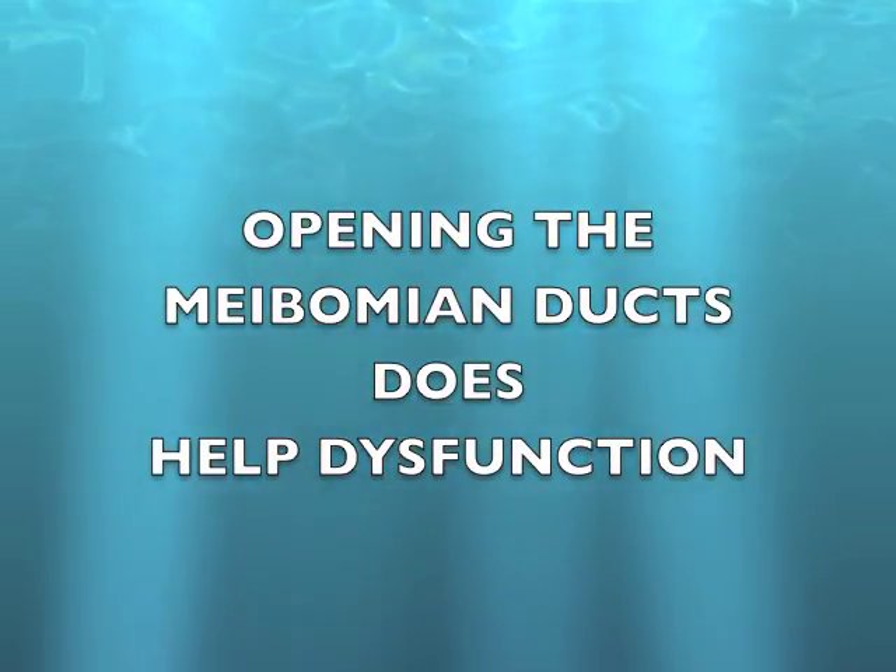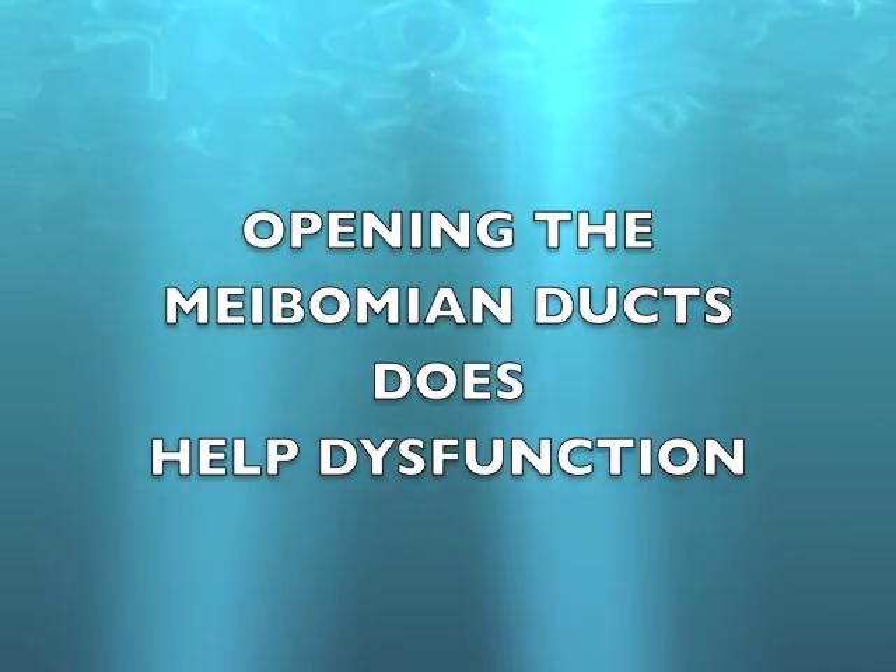Now you compress the two lids together. Pressing the lids together brings out the secretions. That is the whole purpose of treating meibomian gland dysfunction with Fugoblade. I am not aware of any other tool which can perform this kind of operation. I have done many cases and find that every patient gets significant relief. Opening the meibomian ducts does help dysfunction of meibomian glands.